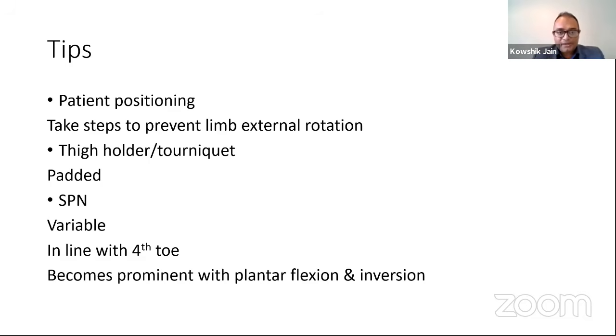Always pad your thigh gutter or the thigh holder. I think in the photograph that was shown, there was a big foam between the thigh and the thigh gutter. That's very, very important. When you're performing arthroscopic fusion, the patient will be in a distractor for easily over an hour, and could be an hour and a half.